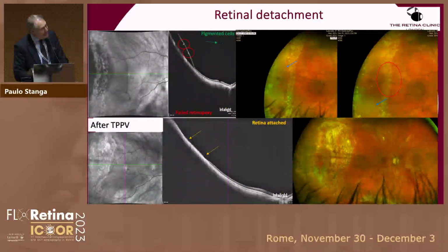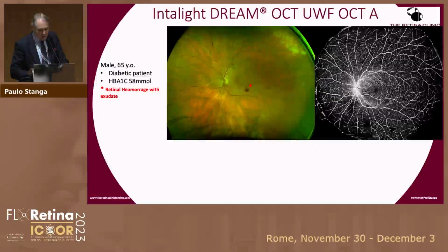This is at only 1 week post-treatment, a successful response to therapy. Not only can we view this on ultra-widefield multi-wavelength imaging, but we can document the absence of subretinal fluid and the thinning of the neuroretina secondary to the laser treatment.